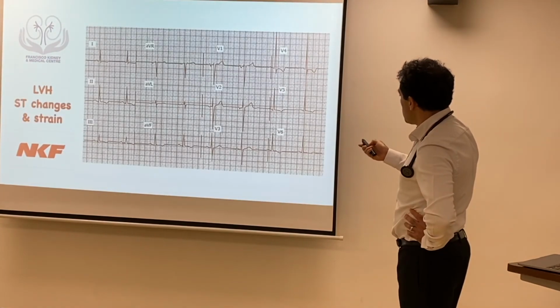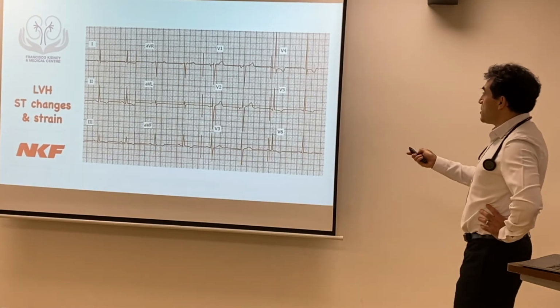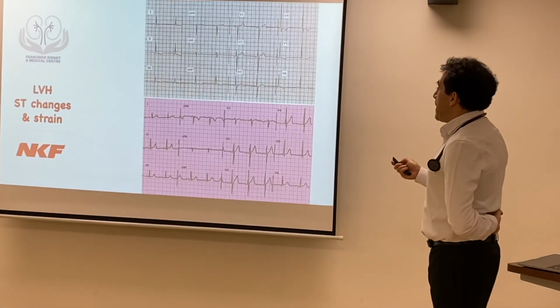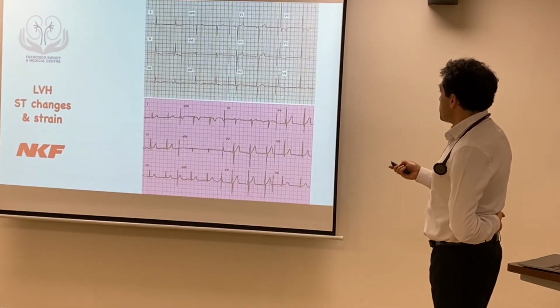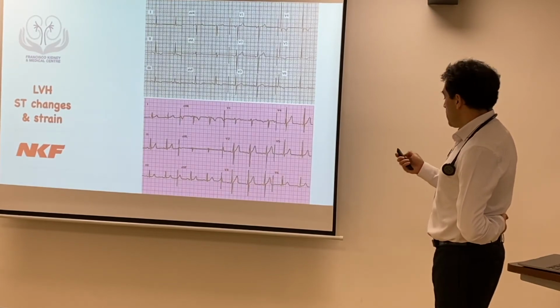But sometimes it can cause ST changes as well, like some people call it ventricular strain, so the ventricle is already struggling a little bit. As you can see, normally the T wave will be positive here.